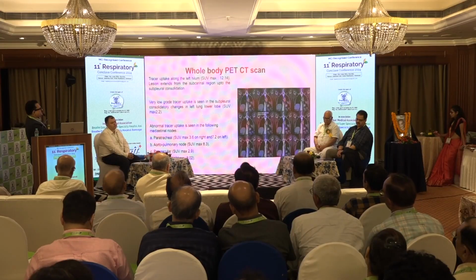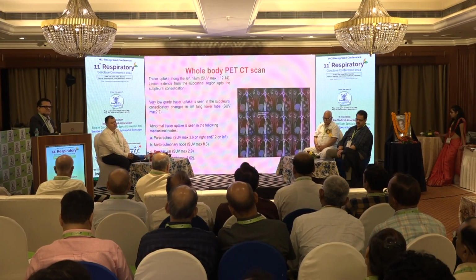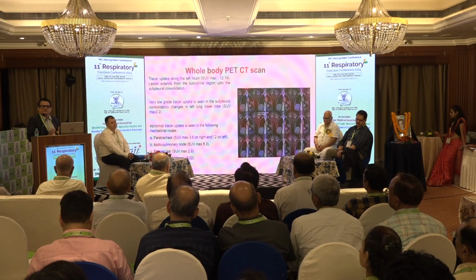In those days, PET scan was available. This is a high-profile patient, so we were able to do a PET scan for this patient. The PET scan, now clearly you see here, you can see the PET uptake in these areas here, and these are the mediastinal lymph nodes which are present.